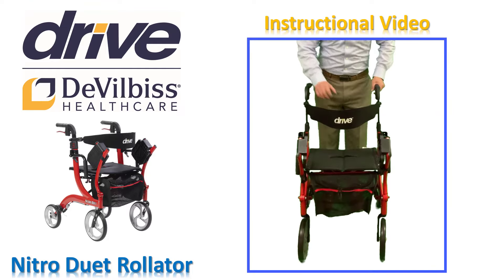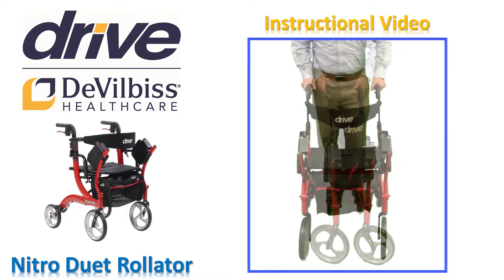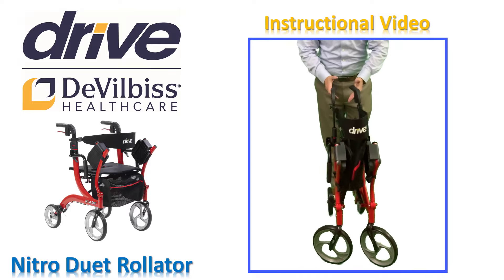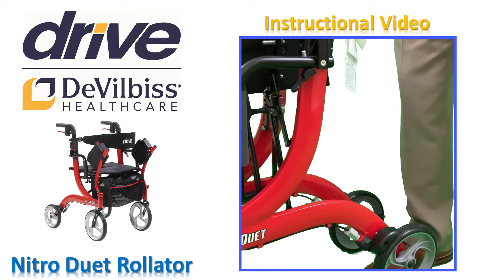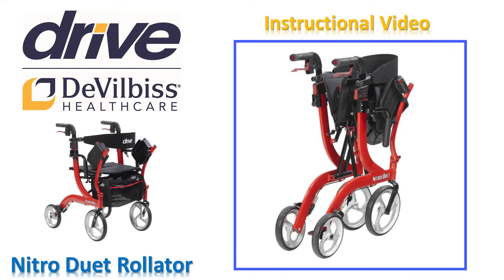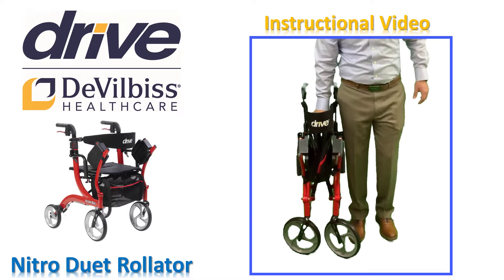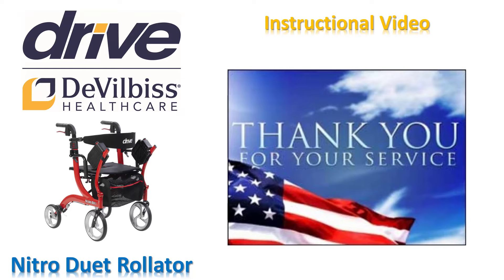When you are finished using your Nitro Duet, you can close the rollator for storage while not in use. To fold, pull the seat upwards by the handle strap in the middle of the seat. The Nitro Duet can be folded completely and securely by pushing the hand grips together. An audible click confirms that the under-seat locking mechanism is engaged and the Nitro Duet is locked into the folded position. See how little space your Nitro Duet takes up when folded. Thank you for your service and enjoy your freedom and mobility for many years to come with your Nitro Duet Rollator by Drive to Vilbis Healthcare.